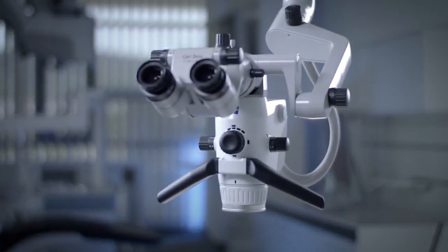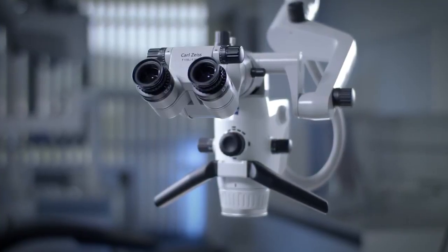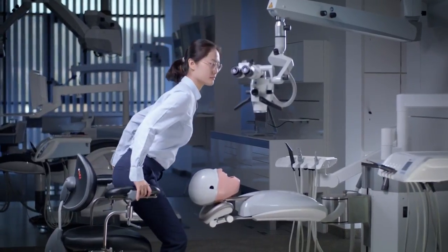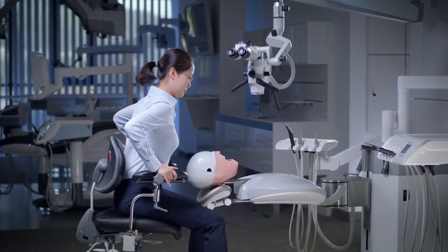An ergonomic working posture is important, preventing back, neck and shoulder pain and increasing your career longevity. Over the next few minutes you will learn how to sit and work ergonomically, using the Zeiss Extaro 300 as an example.